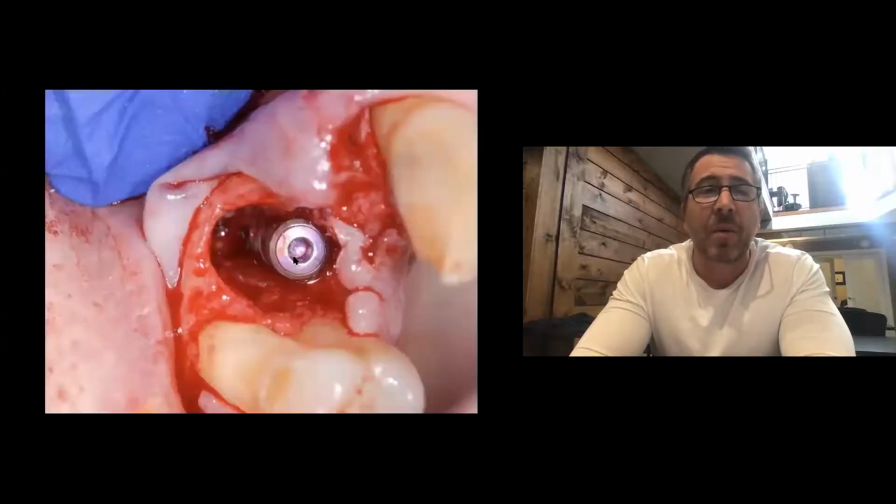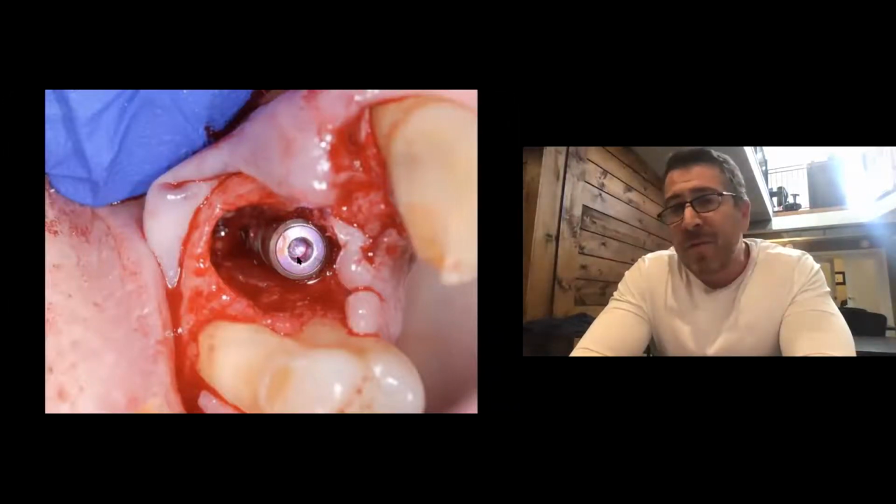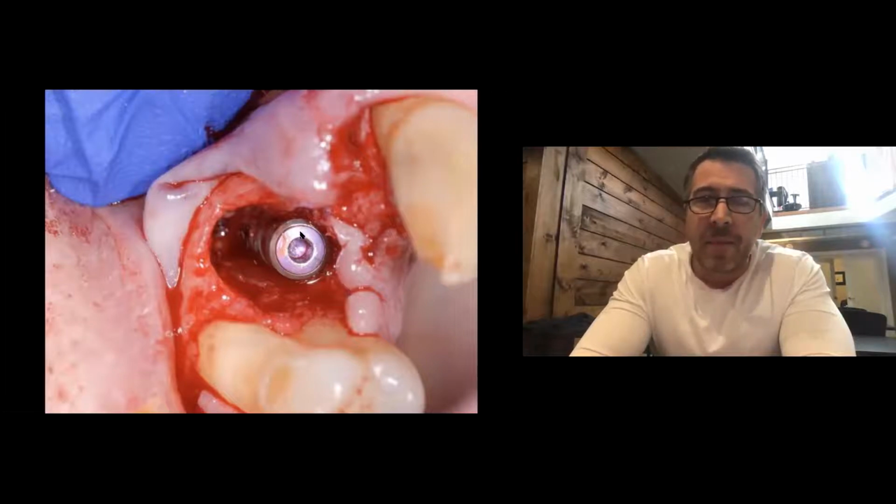So let's look at what the possibilities are. This is an ideal position to me. This is an immediate implant. You can look at the implant coming through the cingulum of the proposed tooth. I've got lots of space between the implant and the buccal plate. I'm going to graft that into place. And if you can imagine, can you guys see my cursor? Yes, we can. Okay, perfect.